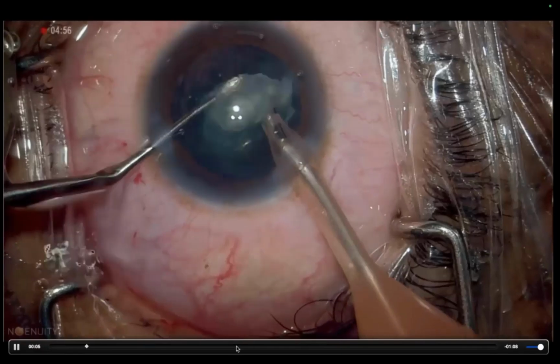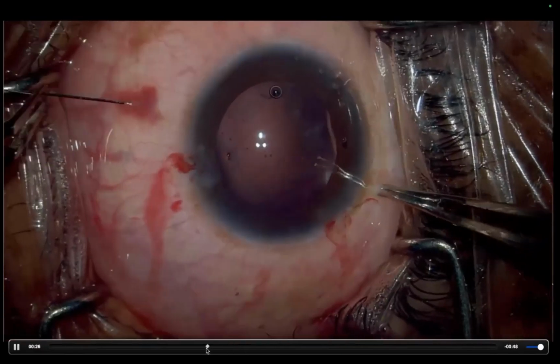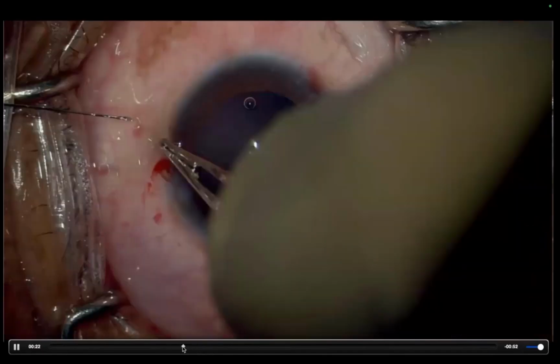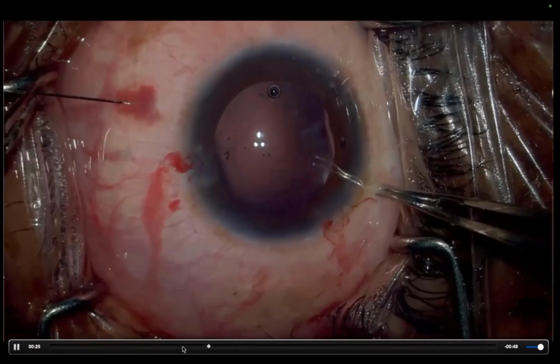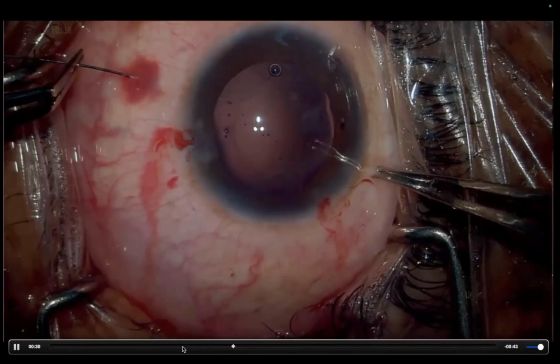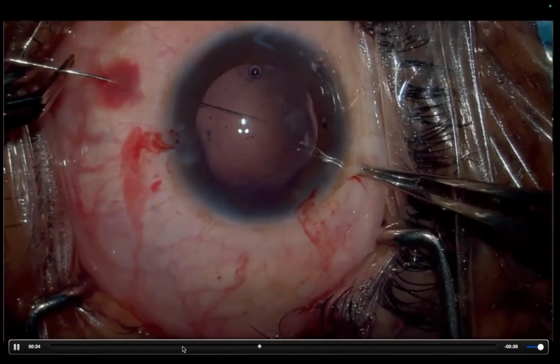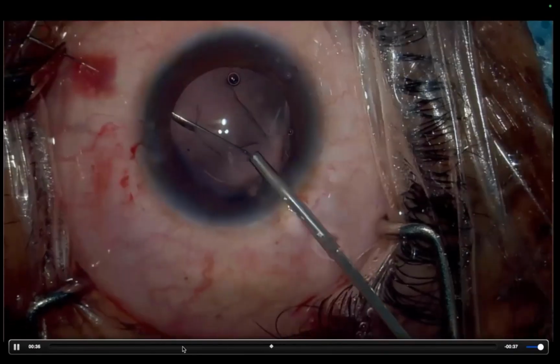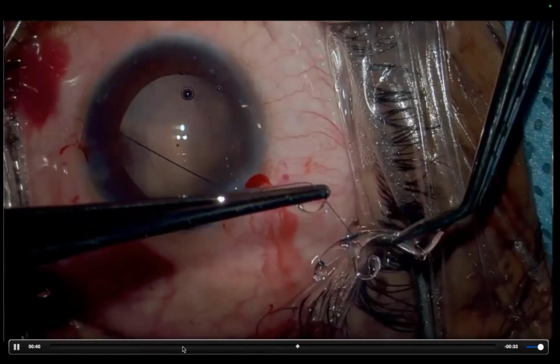So I'll just quickly go through the steps. In a similar fashion to how we explained, move the conjunctiva tenons before you make the sclerotomy. Here, you don't go perpendicular to the globe, you go parallel to the iris, because if you go perpendicular, you'll go into the vitreous. So you go parallel to the iris plane. And then the needle is passed and, using the same viscocannula device, the needle is brought out.